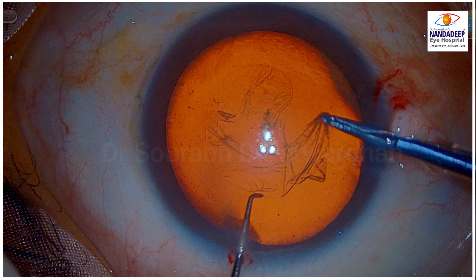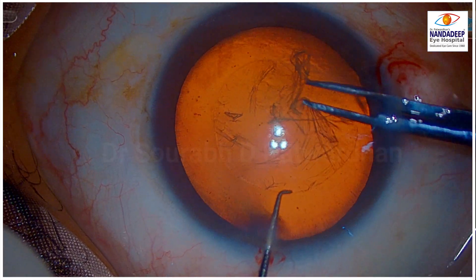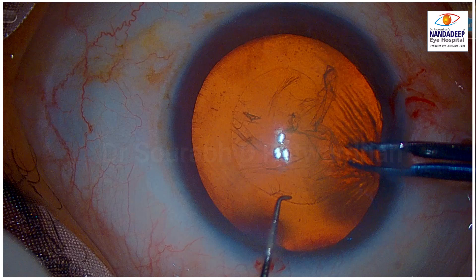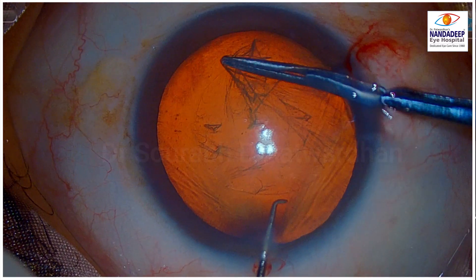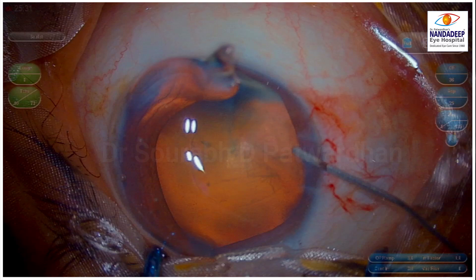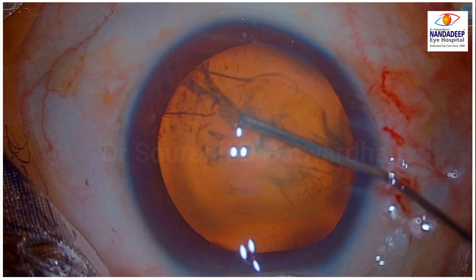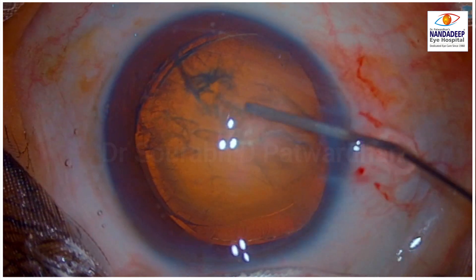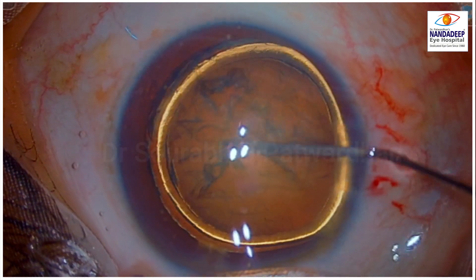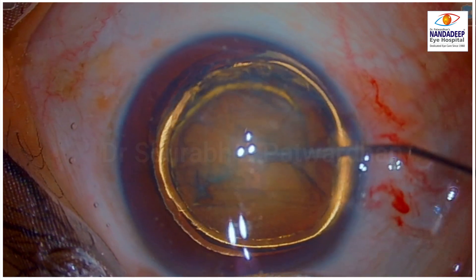Here I was going with the capsulorhexis forceps, and you can see it was going a little bigger, so I readjusted and then I completed the rexis. The hydro dissection is very very important. Here the hydro dissection should be a little bit forceful. So after the initial waves, you can continue to push some more fluid. If you get hydro delineation as well, it will shrink the size of the nucleus.